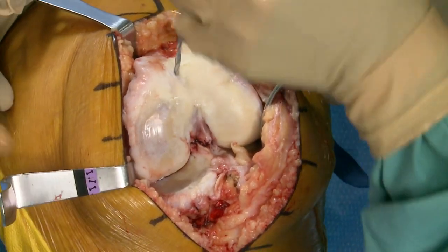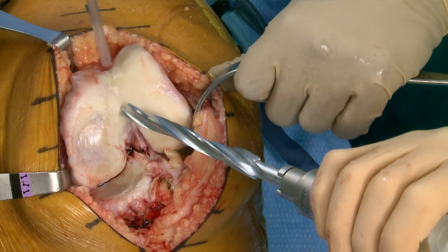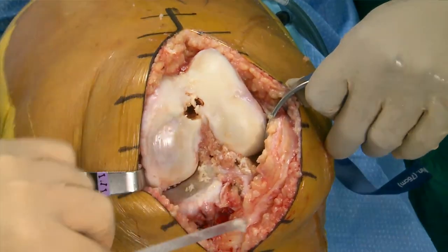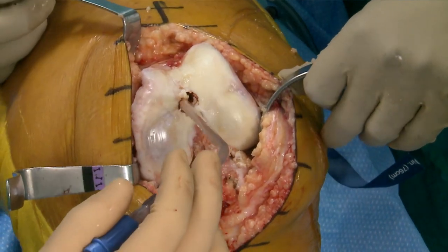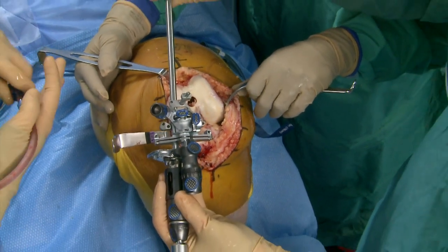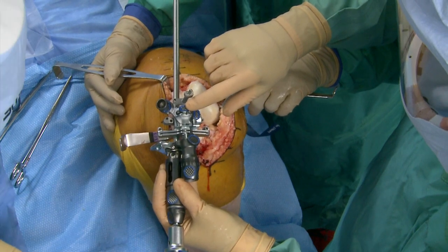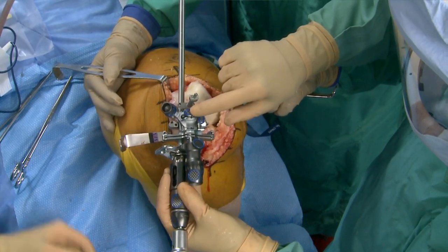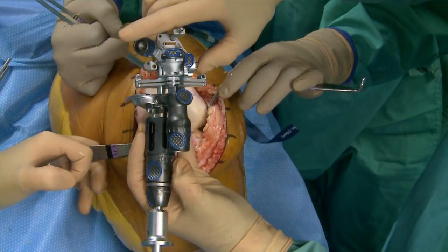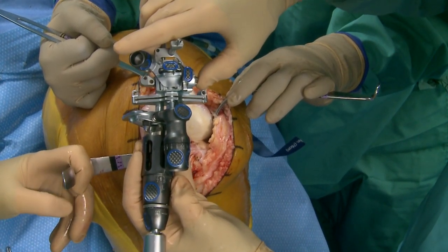I'm going to cut the distal femur first. I do a little blowhole here because it decompresses, and we're putting the bigger reamer up the intramedullary canal. We're using navigation but with the GPS Plus application — combining it with traditional instrumentation. The IM setup is exactly what I'd use with a non-navigated case except the block is a little different with three adjustment knobs: flexion-extension, varus-valgus, and depth. We're doing five degrees of anatomic valgus on the left side and a 10 millimeter resection.